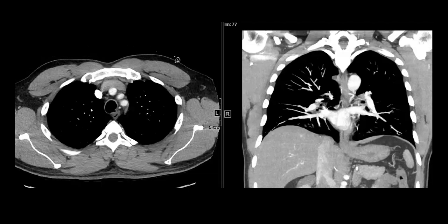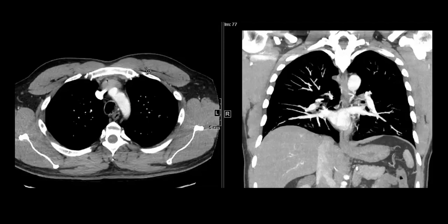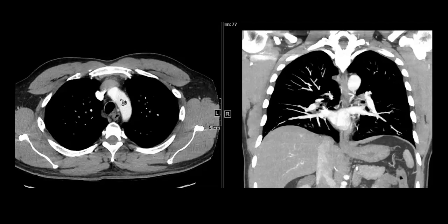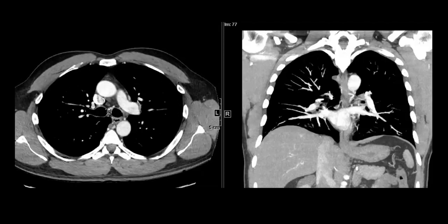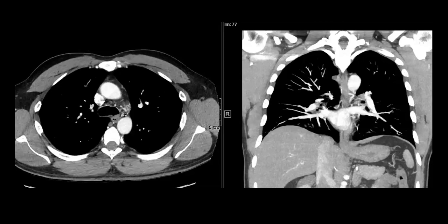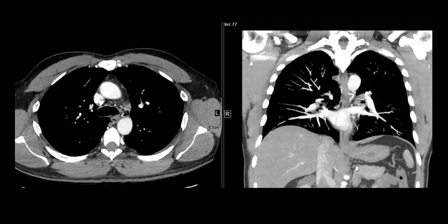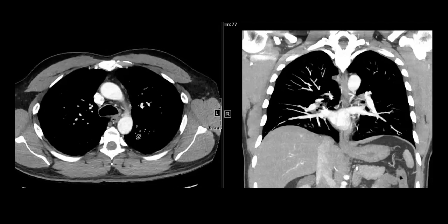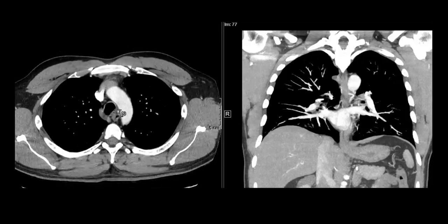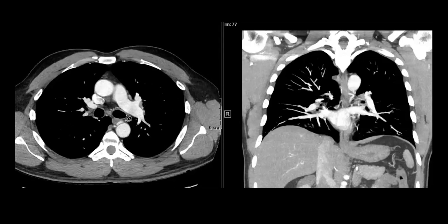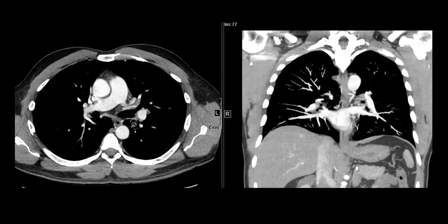Let me start annotations so that those who are not able to see these findings will be able to follow. Do you see this artery here? If you trace these arteries — do you see there are these bunches of tortuous arteries which we usually do not see in the mediastinum? We're used to seeing large arteries such as the arch and the pulmonary artery and their main branches, but there are these additional dilated tortuous arteries which should not be here. These are dilated bronchial arteries — bronchial arteries which have hypertrophied.